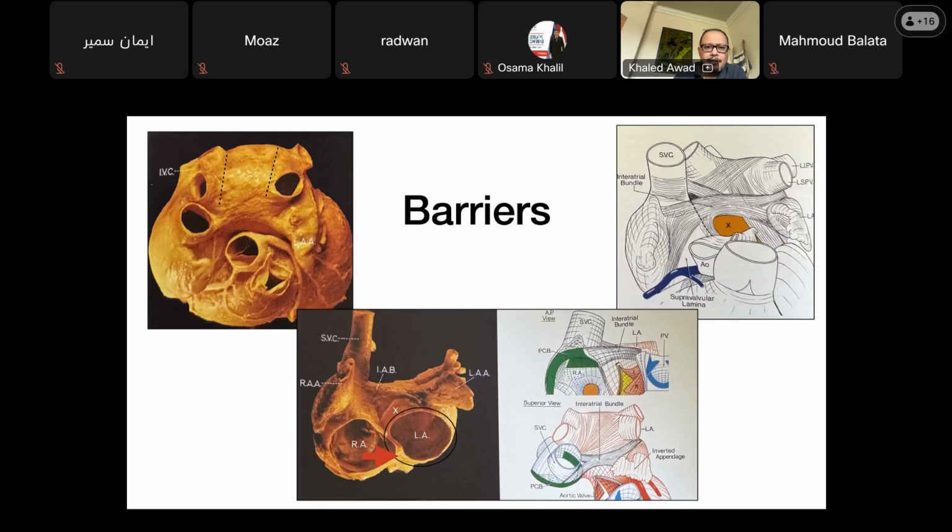Sorry, I didn't make a really good slide for that, but essentially, if you look here, top left, the lateral line would be going from the left inferior pulmonary vein towards the mitral annulus. So this is the left inferior towards the mitral annulus, ablate that area. That area actually does have thick tissue. The coronary sinus is running right there. So you can get through the coronary sinus, address the epicardial part with ablation up here. You're going to be dealing with high impedance. You're going to have to deliver lower power.